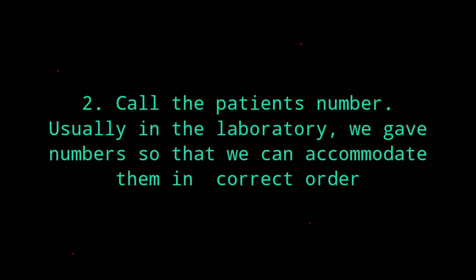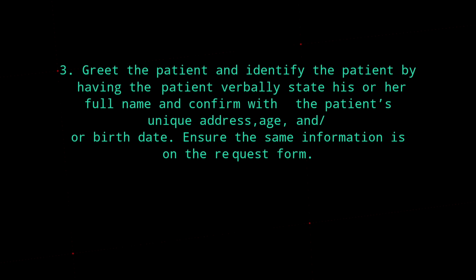Second step is we have to call the patient's number. Usually in the laboratory, we give numbers so that we can accommodate them in the correct order. Next is greet the patient and identify the patient by having the patient verbally state his or her full name. Dapat sabihin niya yung buong pangalan niya.